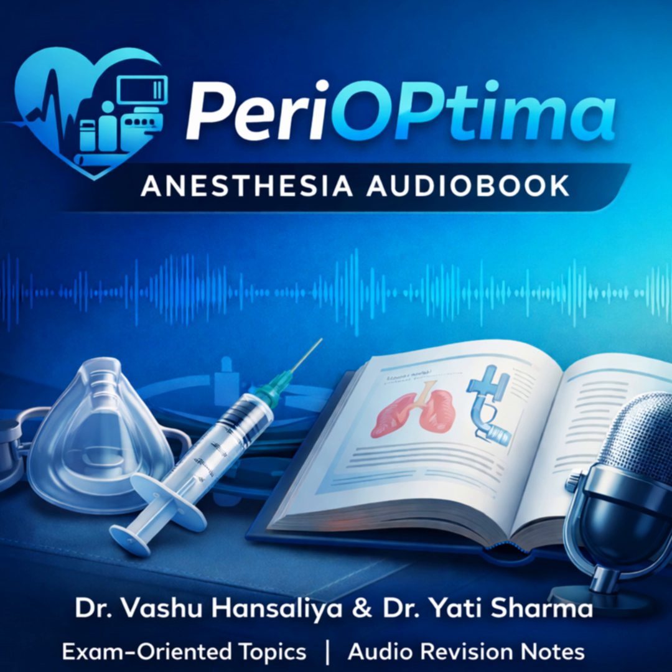So a simple mnemonic. VA has an A for artery and A for assisting the heart. VV is just vein to vein, just for oxygenation. That's a perfect way to remember it.